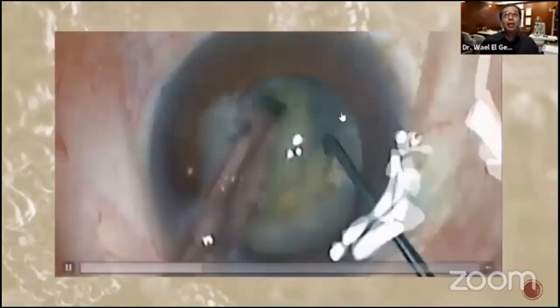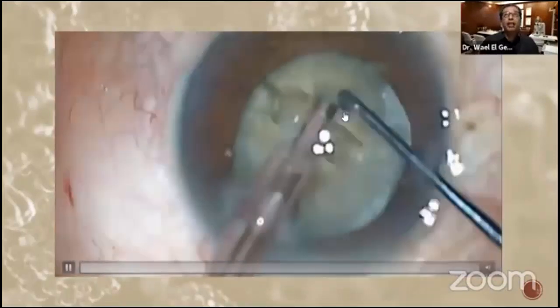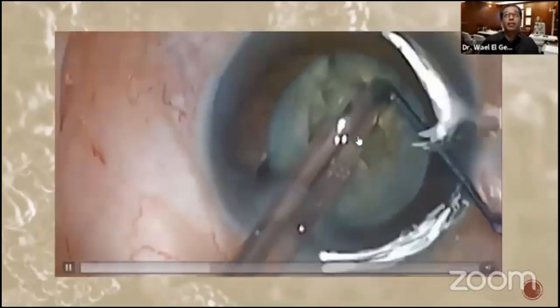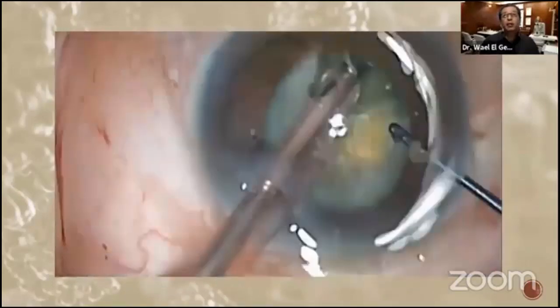When I do the division, I try to do it as peripheral as possible, and as you can see, I split the fibers away from each other. Here, the gutter was a little bit short. I should have extended it a little bit more to help myself with the division. As you can see, it's resisting division a little bit. So what I will do is I will skip it and I will ignore this part.